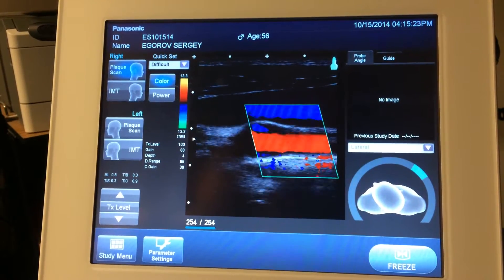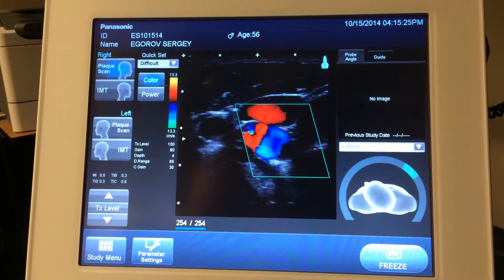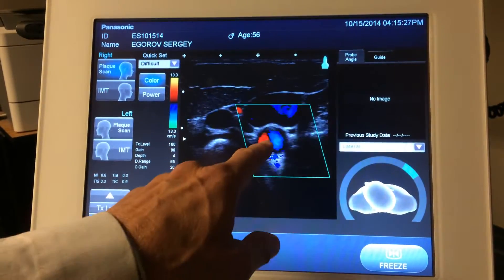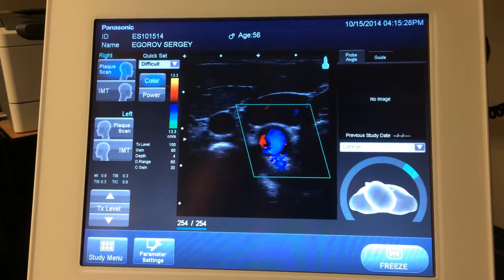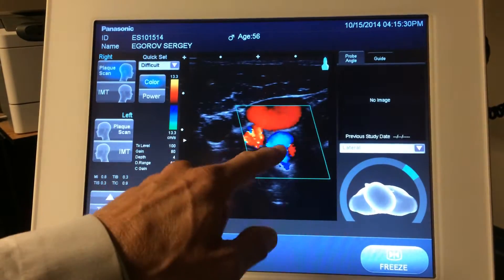So if we look at it, for example, in the short axis view, you can see that better. Here we have one artery, now two arteries.